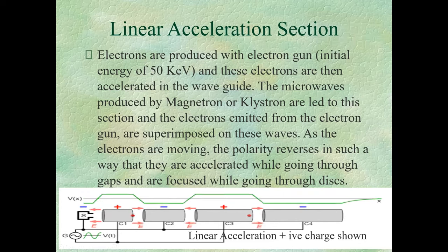was thinking to change to 270 degrees because this gives us better results. So as of today, I don't know if Elekta has moved on to 270 degrees or they are still at 90 degrees, but 270 degrees is more optimal than 90 degrees. But we do have accelerators with 90 degrees.